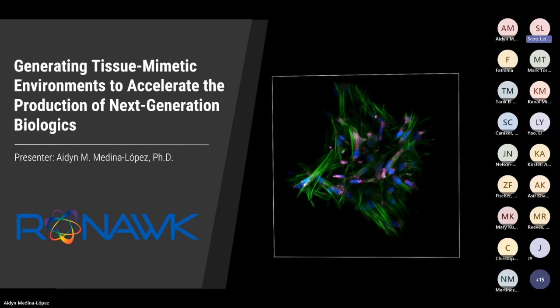So last question is, if you do 3D staining, will imaging be an issue? I meant the transparency might be an issue. So our bioblock is pretty transparent. It has a refractive index of 1.3, if I'm not wrong. So imaging in the bioblock is quite easy. There are some limitations, and the reason for the limitations is how big our bioblock is.